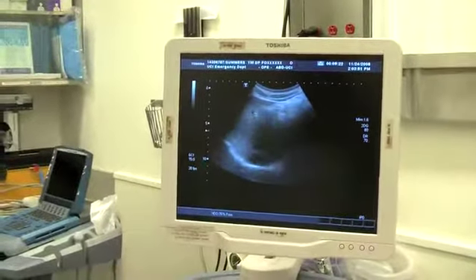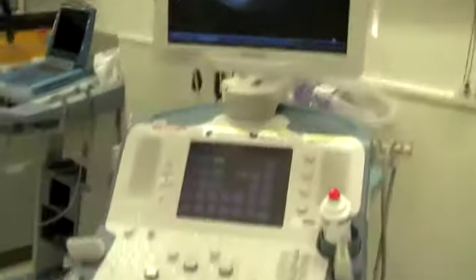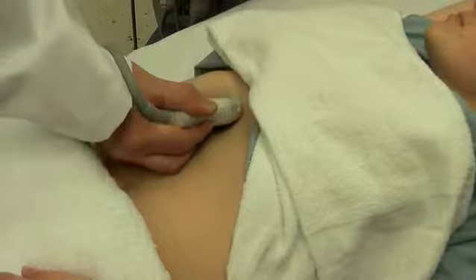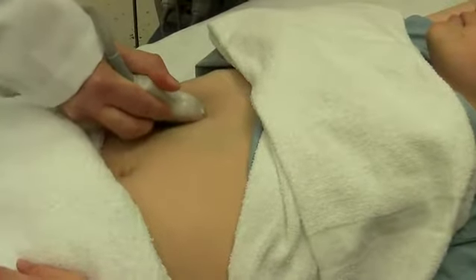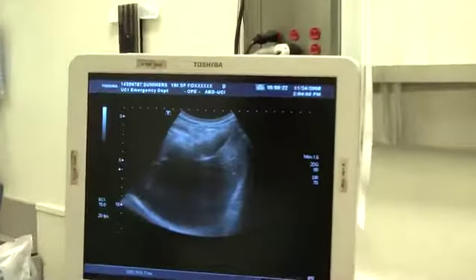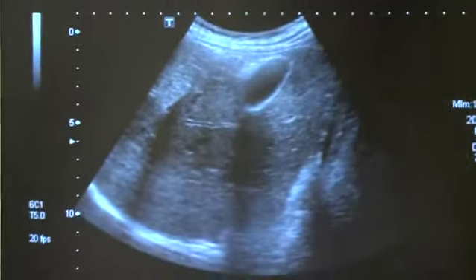And now see how the liver gets a lot prettier? And there's the gallbladder. It's the most anterior tubular structure in the abdomen, and if you were to put flow on it, there's no flow in it. So I know that's the gallbladder. Show us how you put the flow on this.